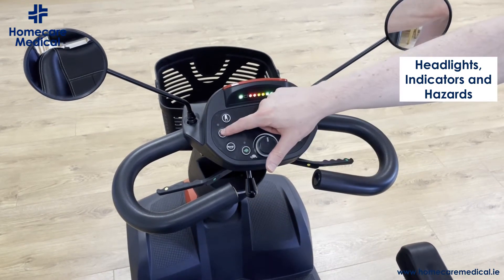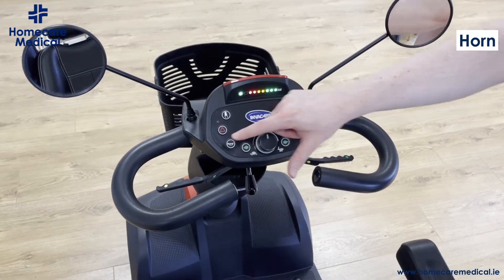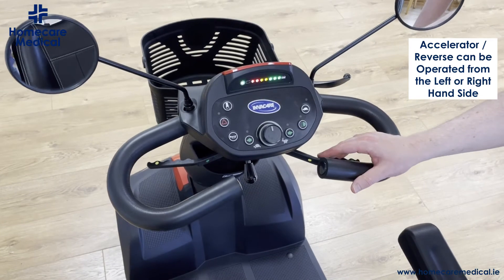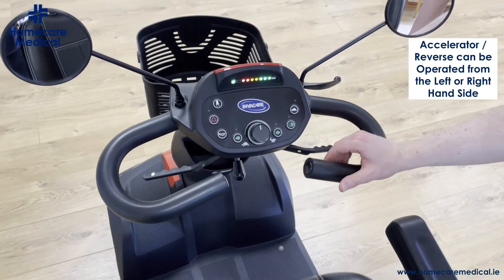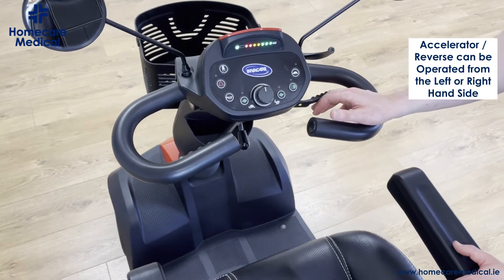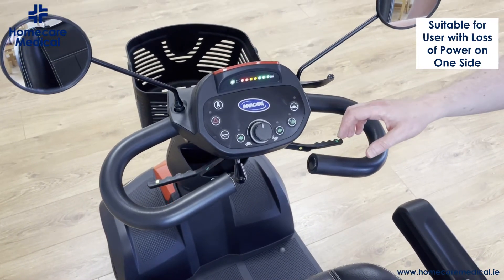This button here will switch on the light system, and you have hazard lights and a horn as well. You accelerate by pulling the right handle, and you can reverse by pushing it away from you.